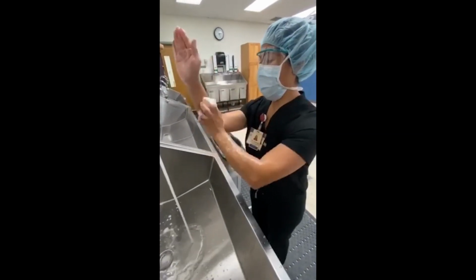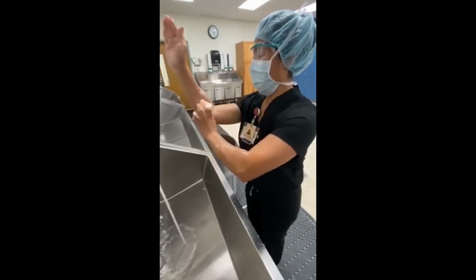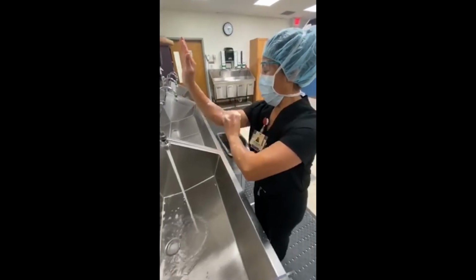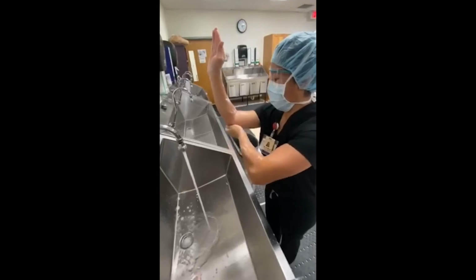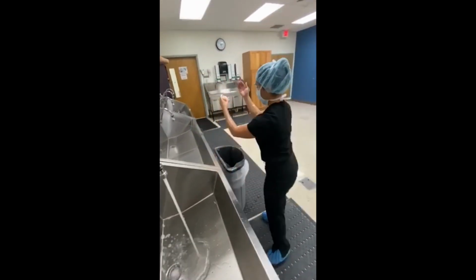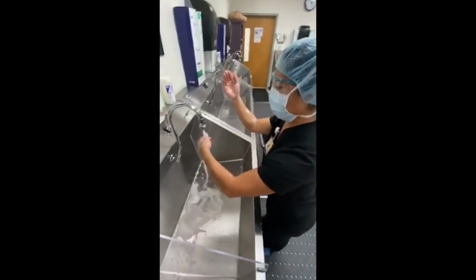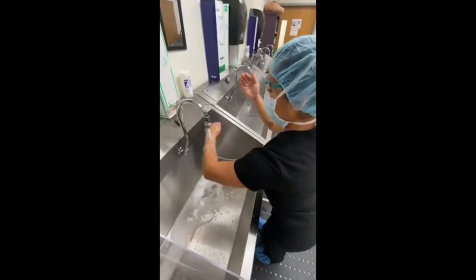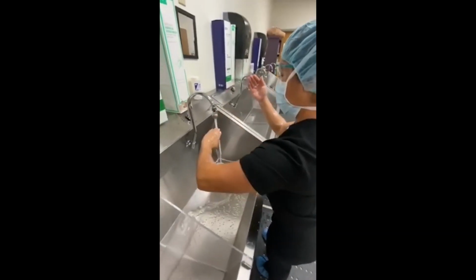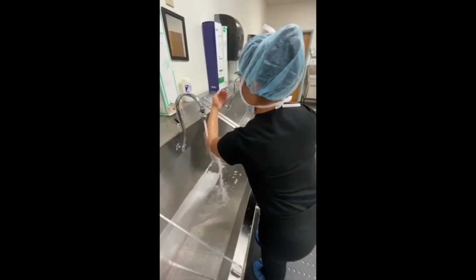Again, she is going in a circular motion, rotating her arm front to back, making her way all the way to 2 inches above the elbow, and a last rotation on the elbow itself. She will turn, drop the brush again from the height up here that you have your arms, never dropping your hand or arm. One forward sweep through the water, beginning at the hand and finishing off at the elbow.